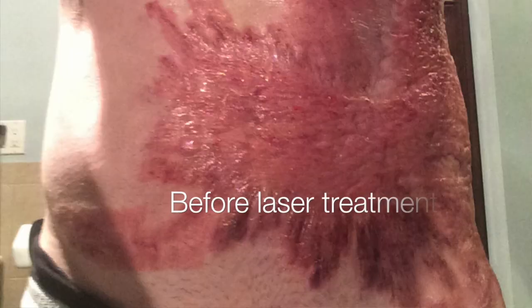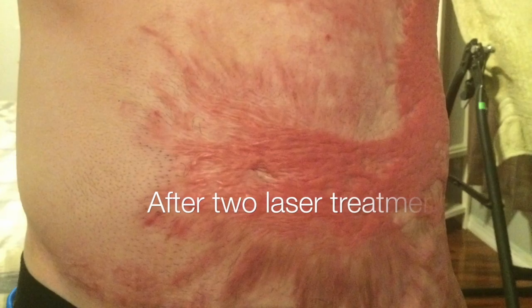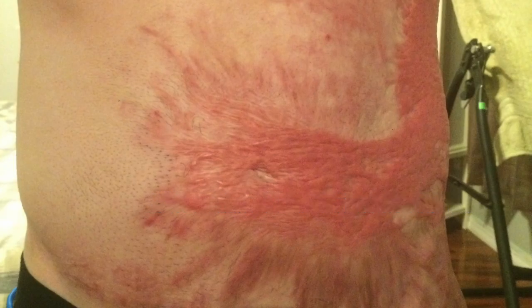The energy will then be decreased to treat the areas that have secondarily healed — healed without skin grafting — which will allow us to get the same depth of penetration while using less energy.